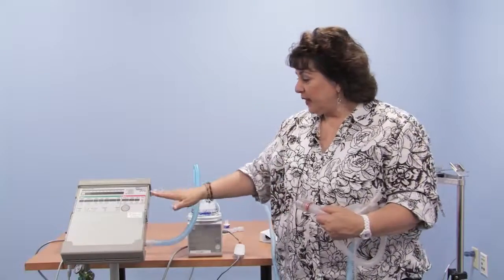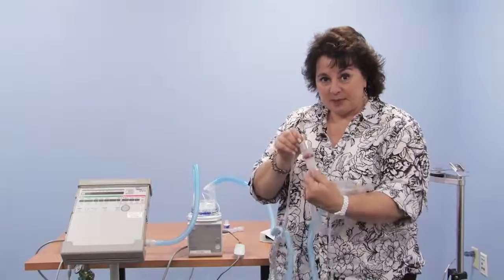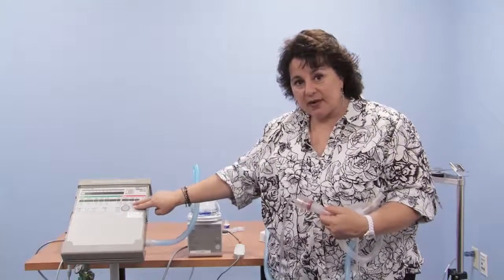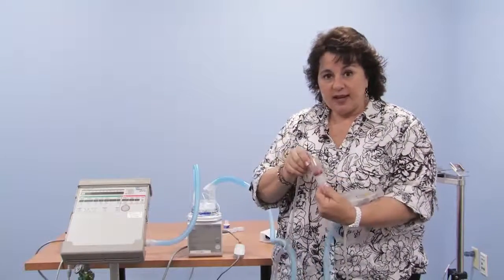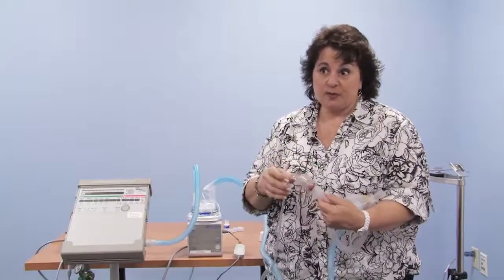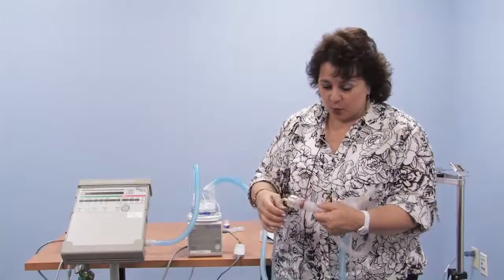So make sure if you're using the 950 model with external PEEP that you have this PEEP valve, and when you're using the 1150 ventilator where PEEP is set on the machine in this space here, that your expiratory valve does not have PEEP on it to be set, or certainly leave it at 0 if you are using this particular type. If there's an emergency and you need a circuit, do not set this PEEP as well.